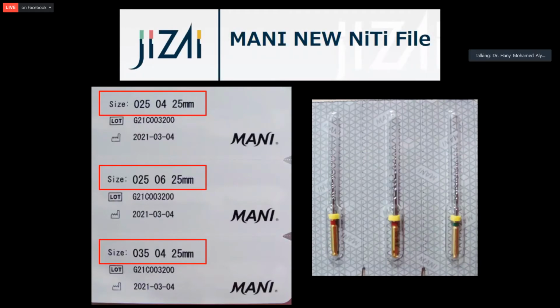The size 25, either taper 0.04, 0.06, or size 35, 0.04 taper.